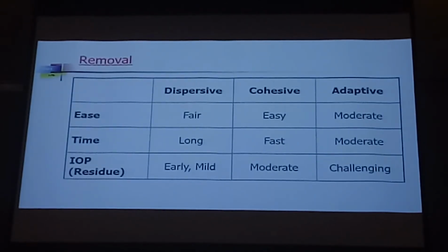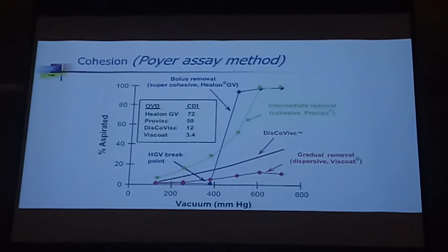It takes some time to remove all of them, because you have to remove all of them. And if any are left behind, even 10%, it's going to cause a lot of IOP problems. So you have to be very careful if you are doing that. Now, this is an important chart.